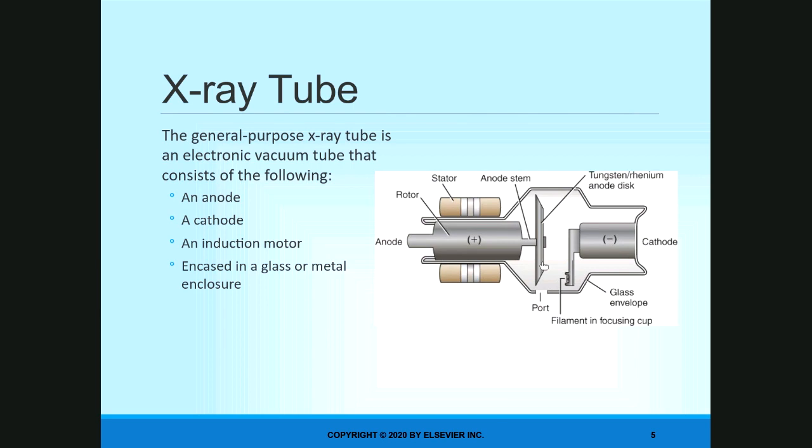So what they end up doing is becoming part of the electricity that flows out of the anode. So when those electrons interact, they can either become radiation, which happens a small amount of the time. They can actually become heat, which happens 99% of the time, or the electrons can continue through the circuitry as part of electricity. All right.